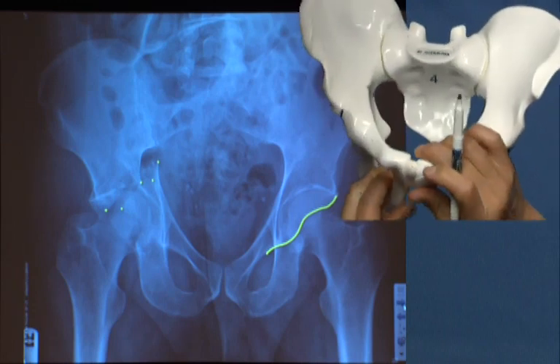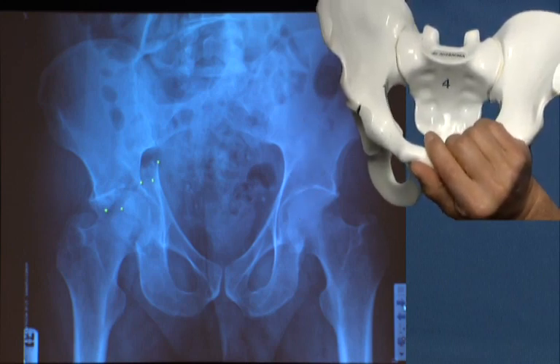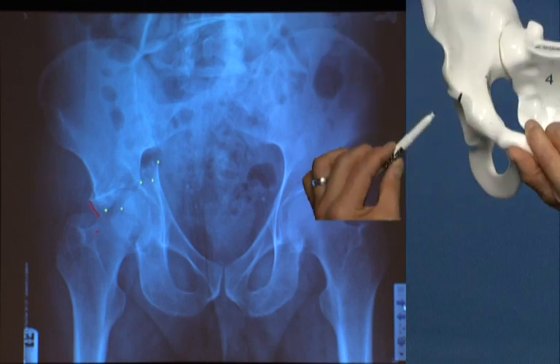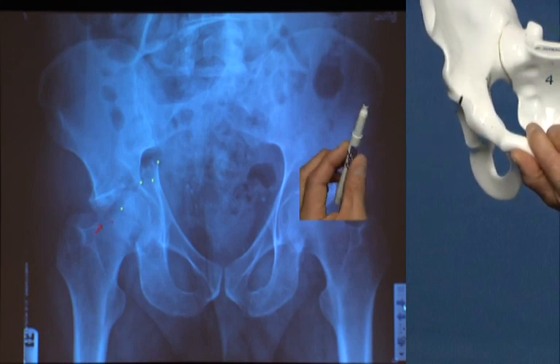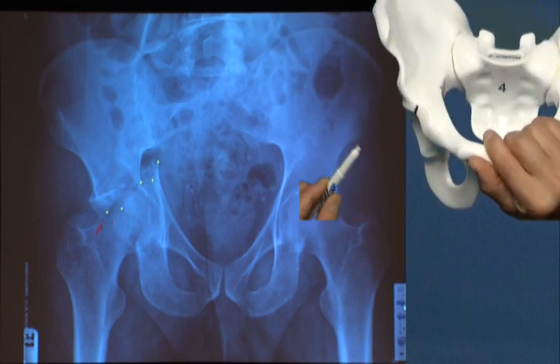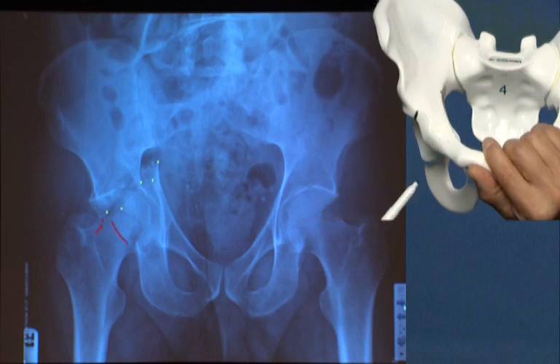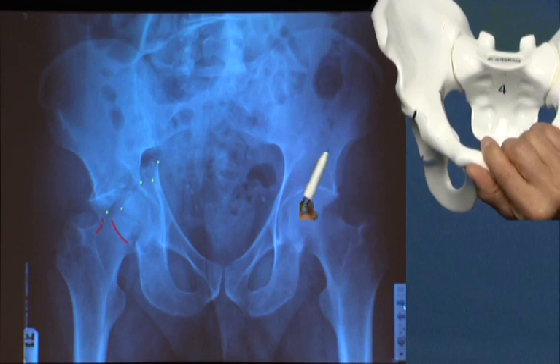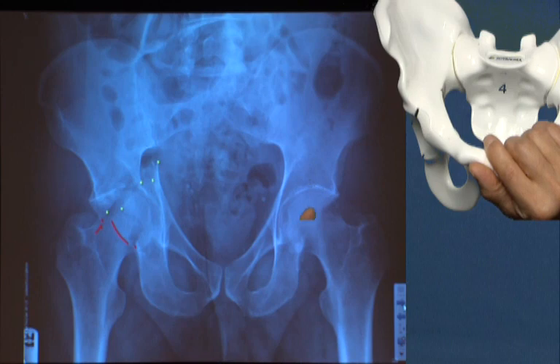Now let's look at the posterior rim shadow. As I follow the posterior rim shadow, my eyes are first drawn to a wide displacement that appears to be in line with the disruption I was seeing in the anterior rim shadow. So if here's my anterior rim shadow, I'm now seeing a disruption of the posterior rim shadow exactly in line with it, and I'll put a mark there to represent that disruption. But as I follow the posterior rim shadow distally, it's intact — until just adjacent to the subcotyloid groove, where I can see a disruption exiting very low on the posterior rim as well, so I'll make a mark there too.